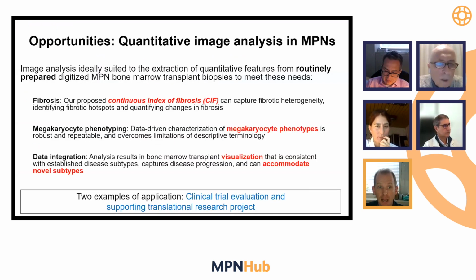Image analysis has a remarkable range of opportunities and possibilities in pathology. For the first time, we can move beyond the text-based descriptive report of biopsies and begin to extract features in a systematic, quantitative way, and move away from this subjective assessment of biopsy reporting to something more systematic and more quantitative. It takes around 10 to 15 years to train a pathologist, and still we have this problem of measuring performance and consistency in pathology reporting.